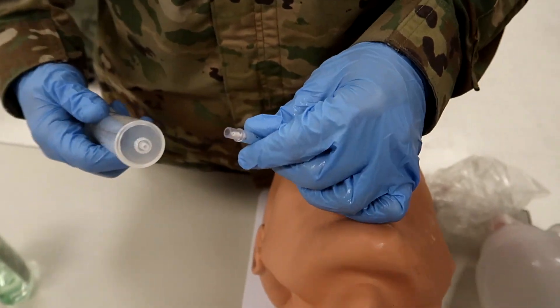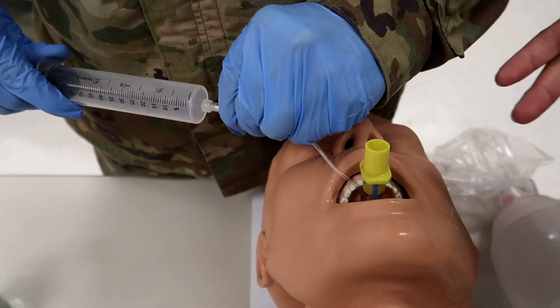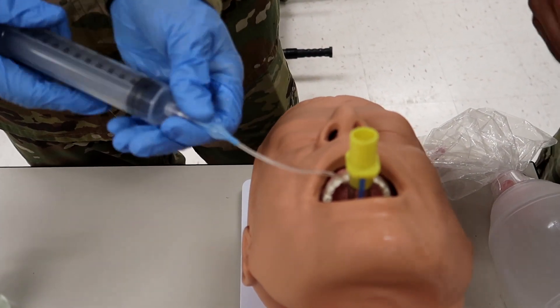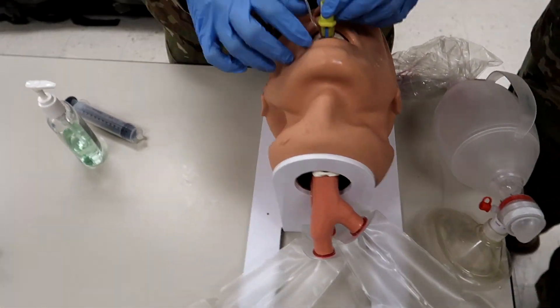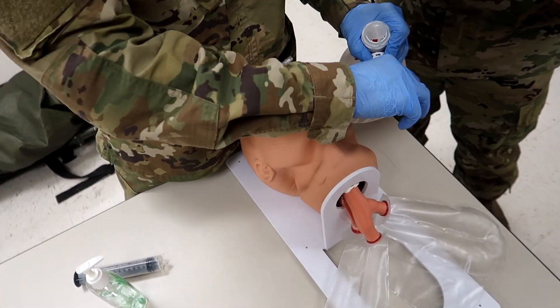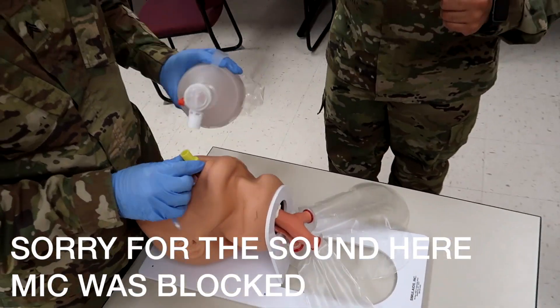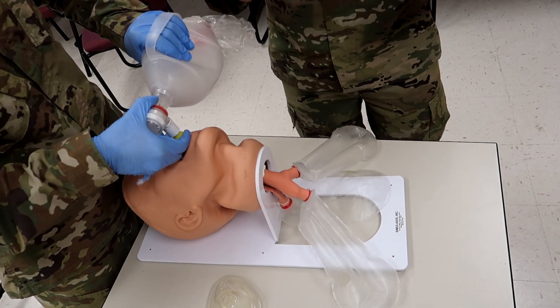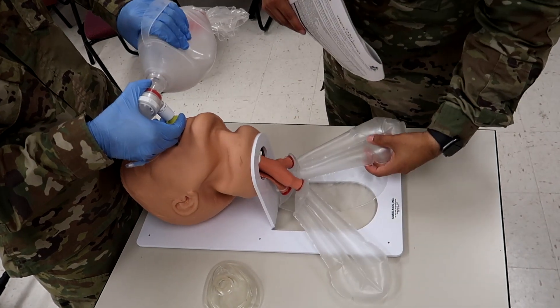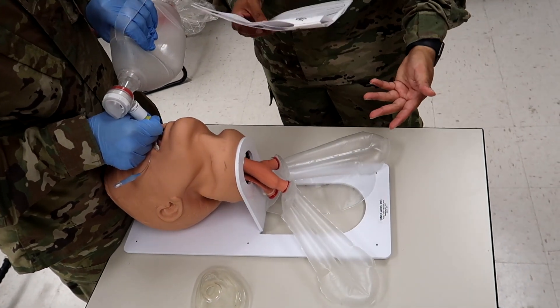Without exerting excessive force, advance the tube until the connectors align with the teeth or the gums. Now he's going to, using the syringe provided, inflate the cuffs of the King LT with the appropriate volume of air. Since this is a medium size, he's going to use at least 60 to 80 milliliters. Now that he's inflated the King LT, he's going to attach the BVM and gently bag the casualty to assess ventilation. He would advance the King LT until ventilation is easy. The lungs are filling out — if they weren't, he would slowly lift the King LT while ventilating to ensure proper placement.